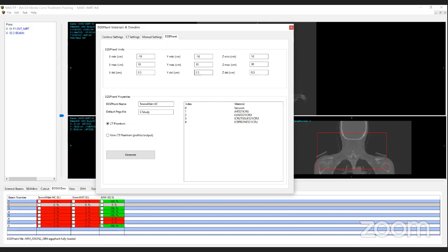Okay. My question is, in our center, we used to have a radiotherapy Elekta machine that has packed up. And also the TPS that we normally use in planning the patients is also faulty. So assuming I want to get the DICOM images or the plans, how are we able to get them without the TPS software running? Is there a way I can go around it, maybe connecting the hard disks to another system to extract them and still get them intact?